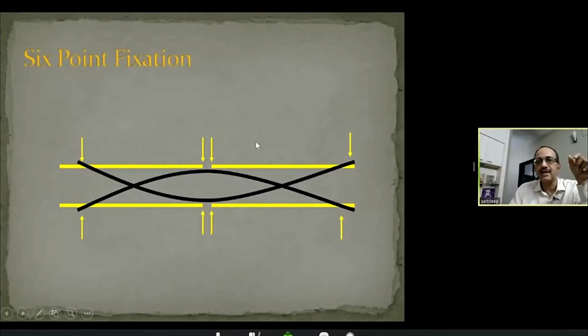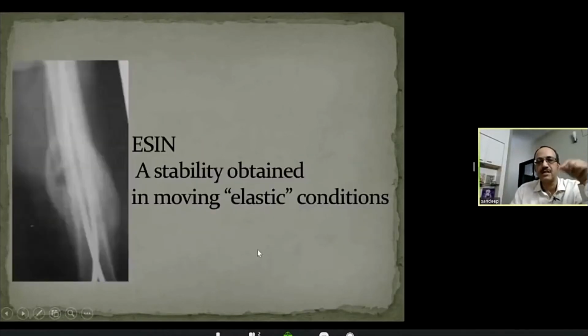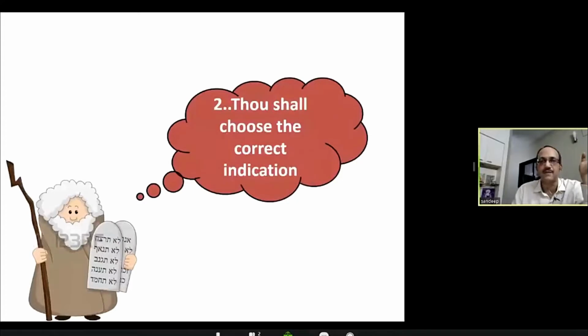And that gives an elastic stability, which under moving conditions creates sufficient early callus with no requirement of a plaster. So the concept of an elastic nailing system itself is different. It is not the same as putting a Rush nail or not the same as putting Ender's nail. So it's technically a more superior biomechanical concept.